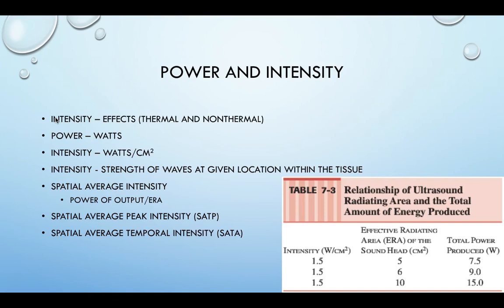If we have a higher intensity, then we're going to have much more energy in that area. We're going to actually raise temperature, and so the main effects we're going to be seeing are thermal. The non-thermal effects are still there. They're just a little bit more overshadowed by the goal of raising the tissue temperature with the thermals. So higher intensities tend to be for our more thermal situations, lower intensities are more non-thermal.